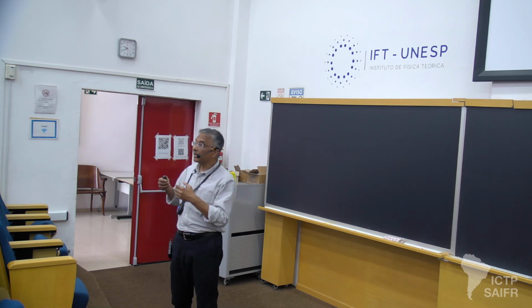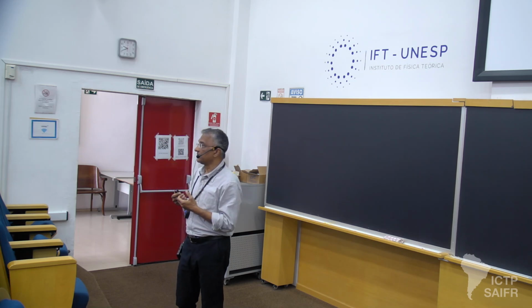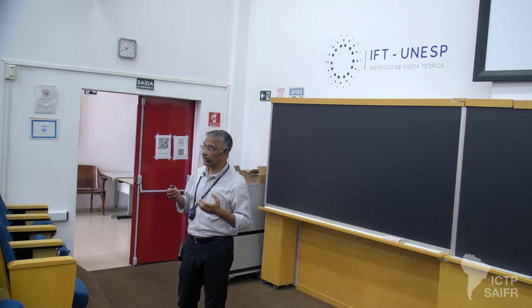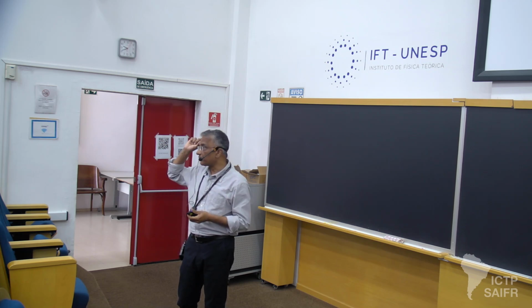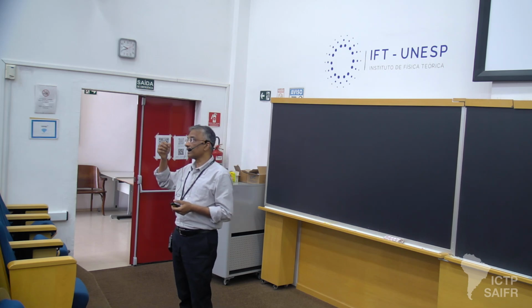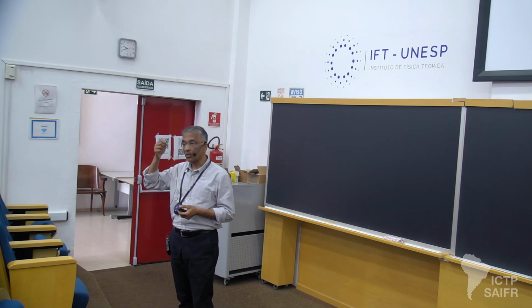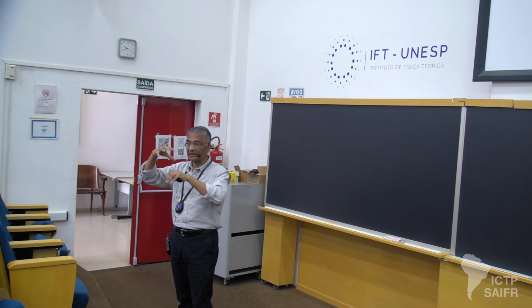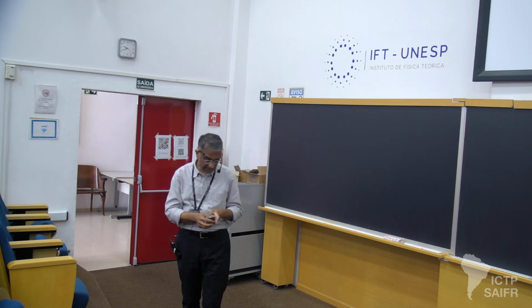We are primarily interested in intracranial EEG. There's a tremendous difference between scalp EEG and intracranial EEG. It might be just a few millimeters apart where the contact is, but the intracranial contact is sitting on the generators or within the generators, while the scalp contact is sitting at a distance and subtending a sort of solid angle and capturing the field within that solid angle.